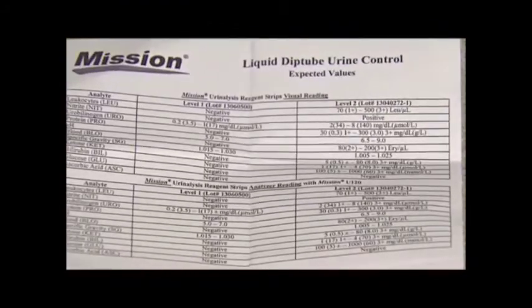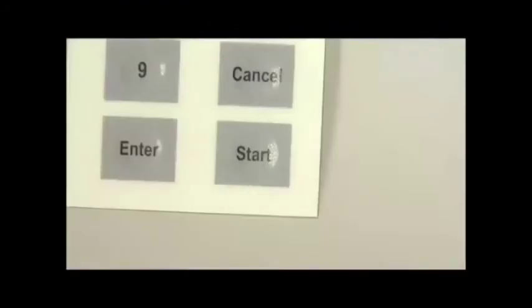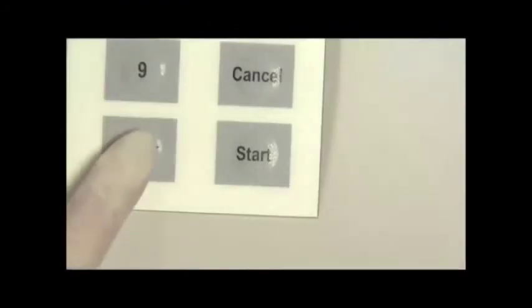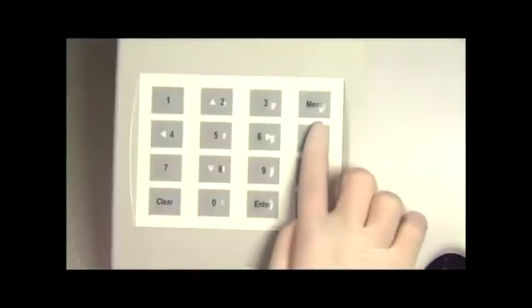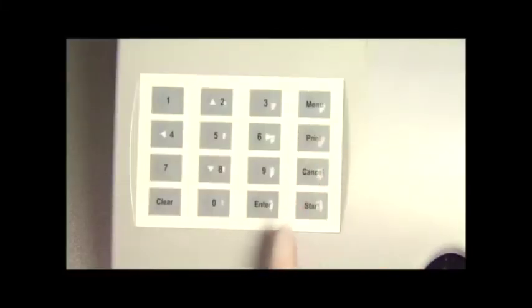Once you input the QC values, press enter to save the changes and exit the screen. Or you can also press print to print the current values.